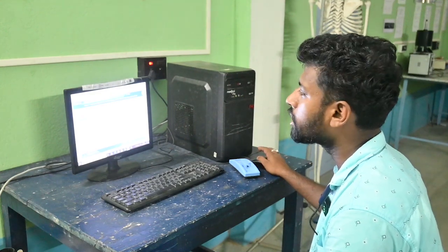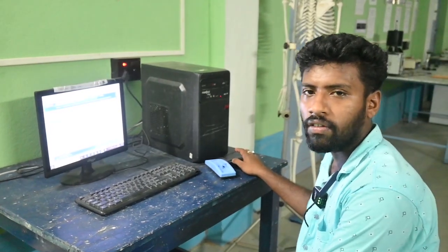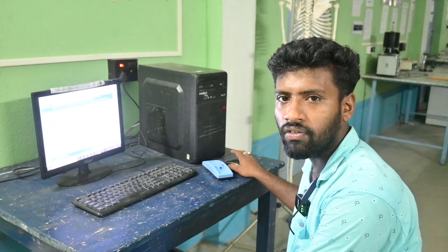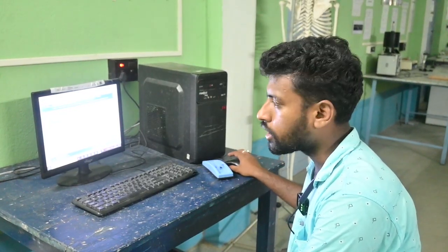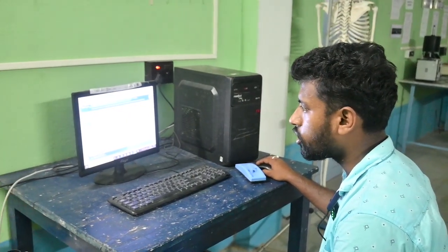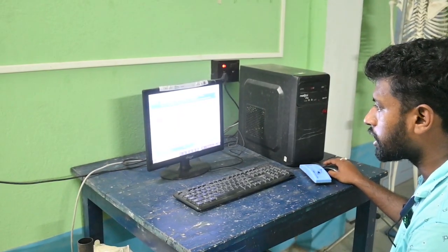Now we are studying the practical, the study of analgesic activity using the hot plate apparatus. At first we are taking one hot plate. Now go into the X.Pharm software. So now these are the hot plate. So to start the experiment.